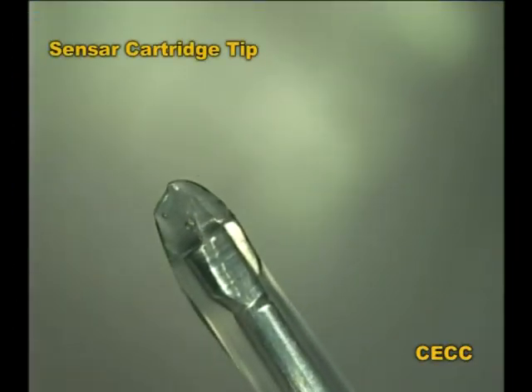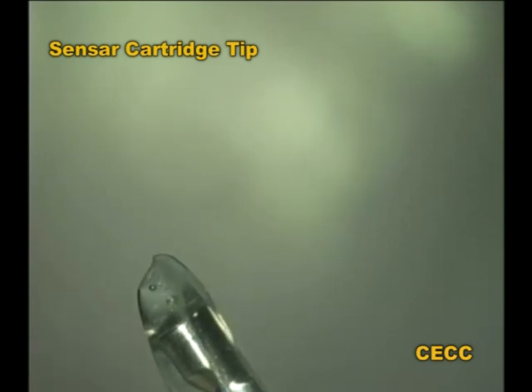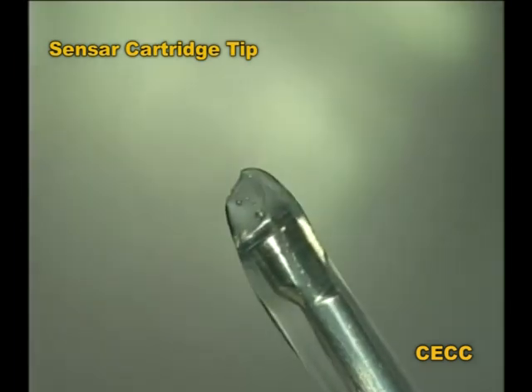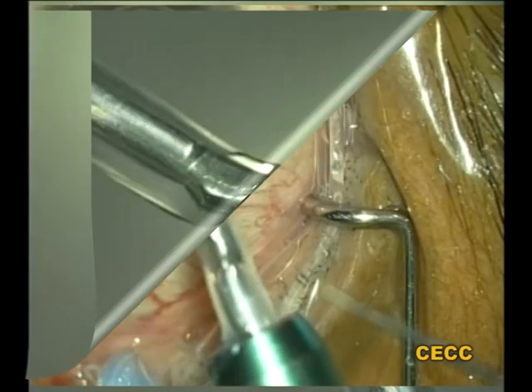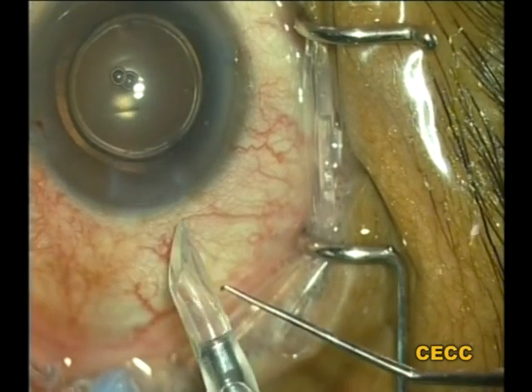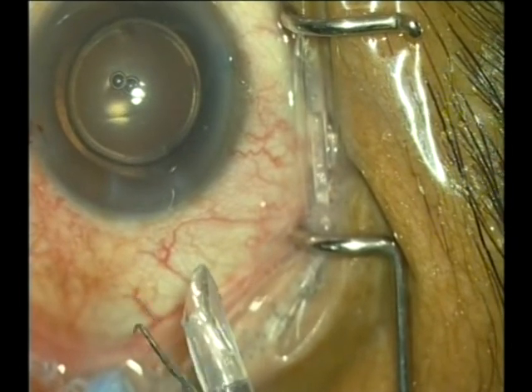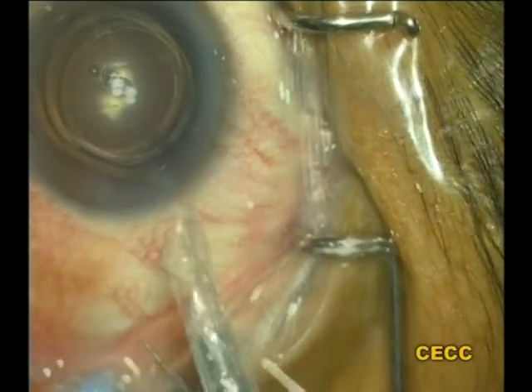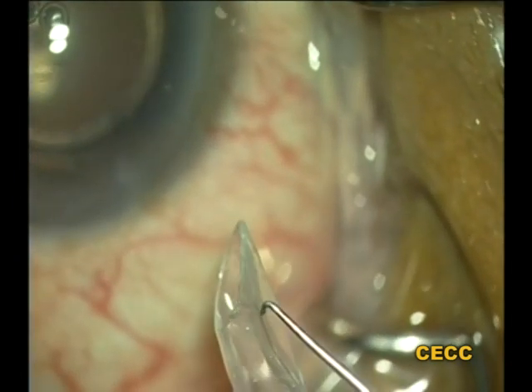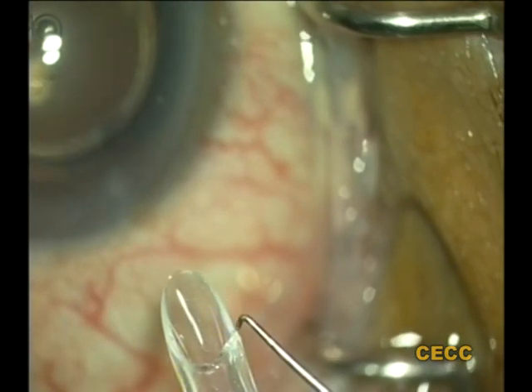This is a cartridge tip of the emerald injector system for the Sensar IOL which was found to be defective. Use of this tip may result in aberration of the optic surface. In yet another similar case, the cartridge damage is not only at the tip but also extends to its lateral surface. If the defects, however subtle they may be, are not picked up during the pre-implantation inspection, avoidable complications may arise. Let us see some of these avoidable complications.